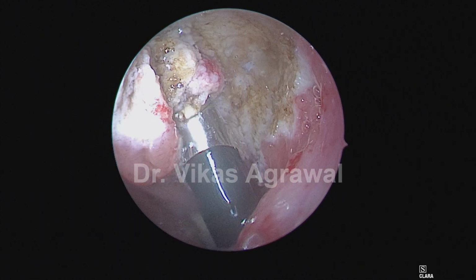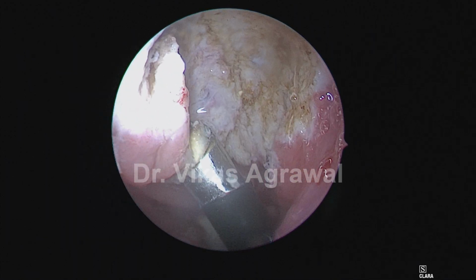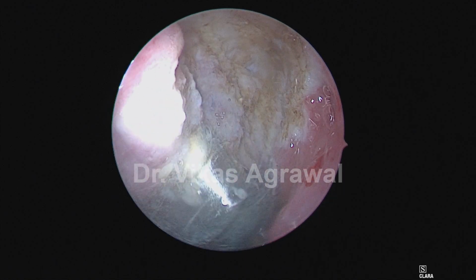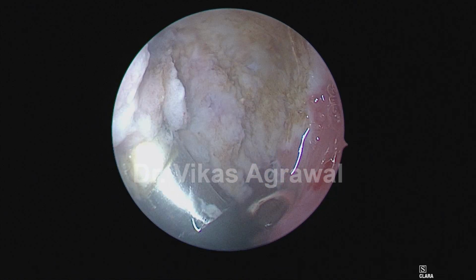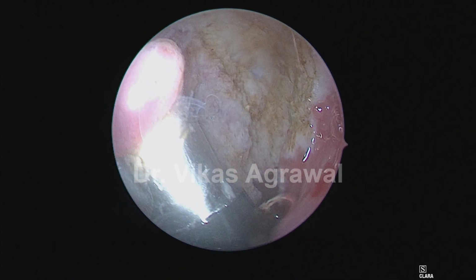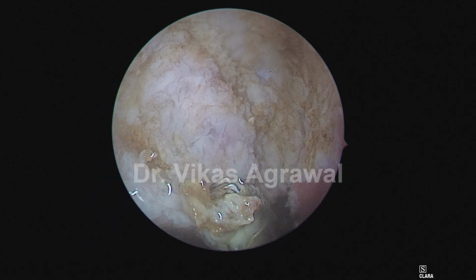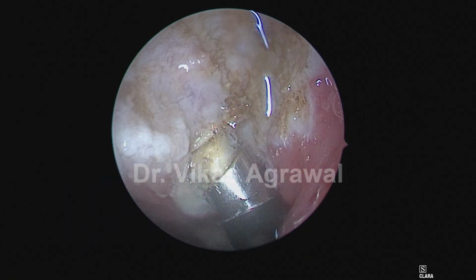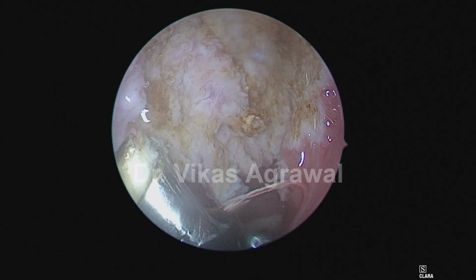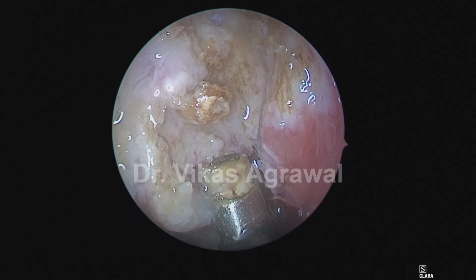Now we are debulking a lot of lymphoid tissue here. And you can imagine how much space will be created for the child to be able to breathe peacefully immediately after the surgery. So this is simple plain debulking. Whatever I am seeing on the right side, I am debulking.